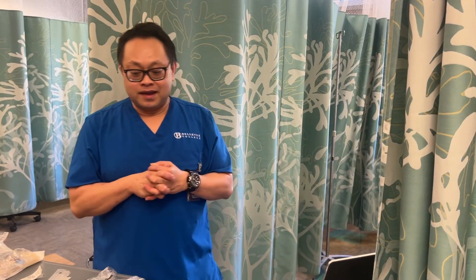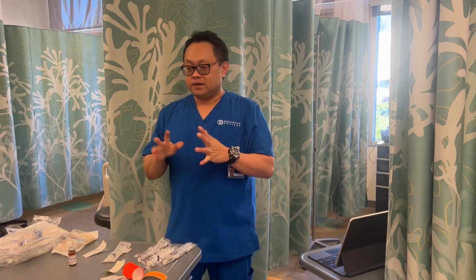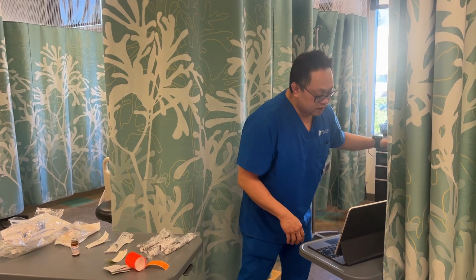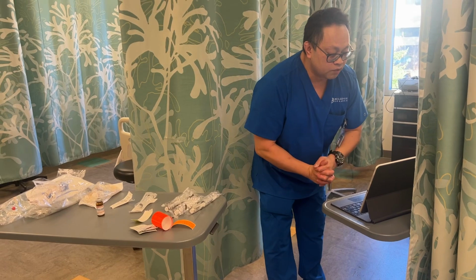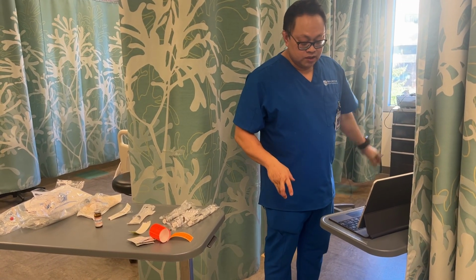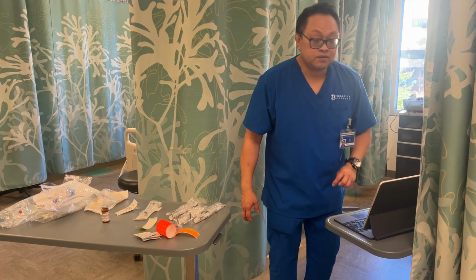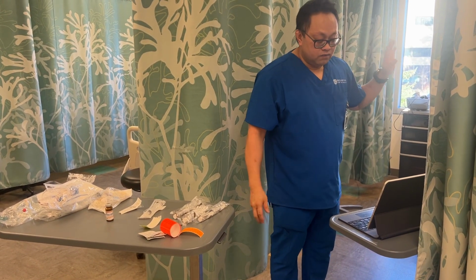My name is Ty, and I'll be doing the IV push medication skills today, the primary and secondary skills. So I'm going to sanitize and get on the MAR. And for the client, what's next up is ondansetron 4 milligrams. And I'll do my calculations before I give the medications. And it is also sodium chloride, 125 mLs per hour, and the ciprofloxacin, which is 400 milligrams over 200 milliliters.